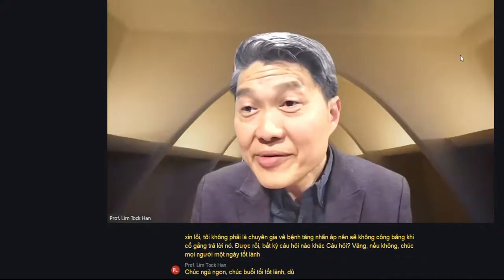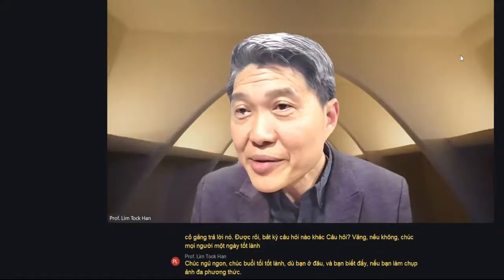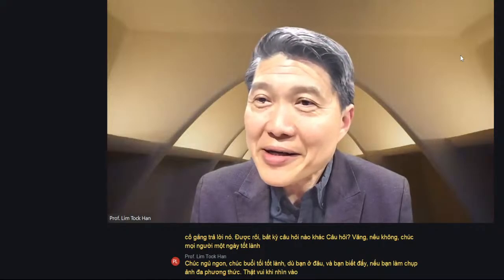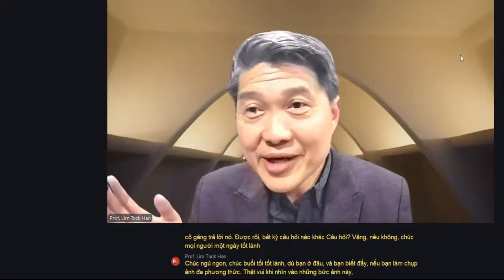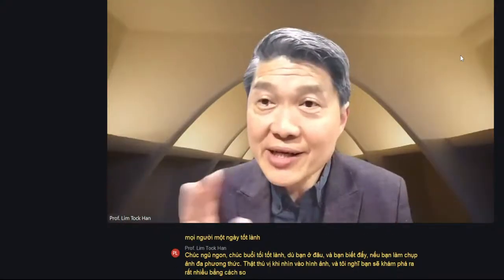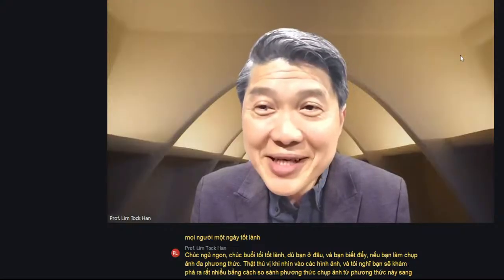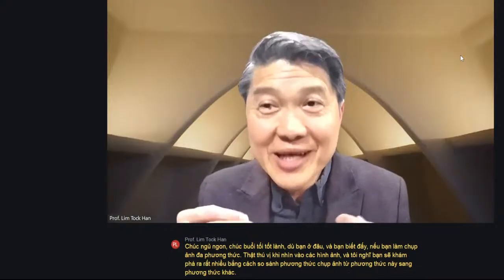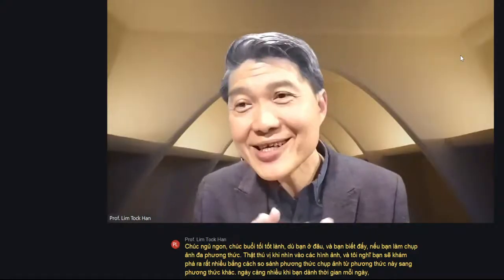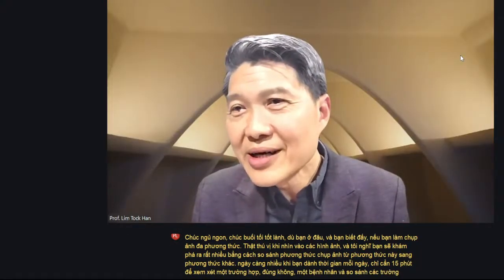And if you do multimodal imaging, have fun looking at the images, and I think you will discover a lot by comparing imaging modality from one to another. You'll learn more and more as you spend some time every day, just 15 minutes, to look at one case, one patient, and compare the different modality across, over time.